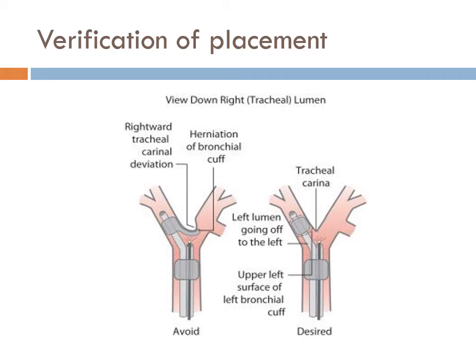And so I went back, had them stop, and looked. It was a dental case, so I listened to the airway. And I put her on volume control on purpose to give 150 cc tidal volumes. And I was getting back like 90, so there was a leak. At that point, we had already put air in it, and what do you think I did?